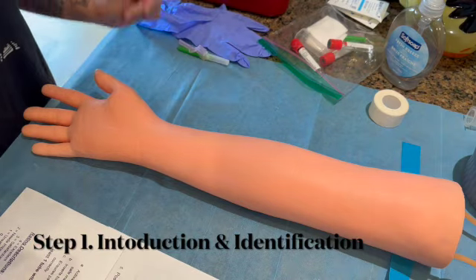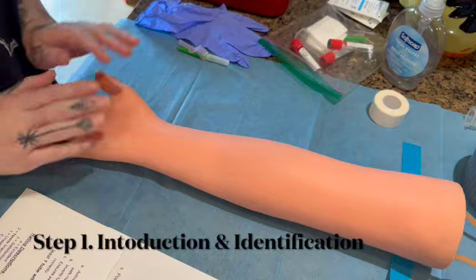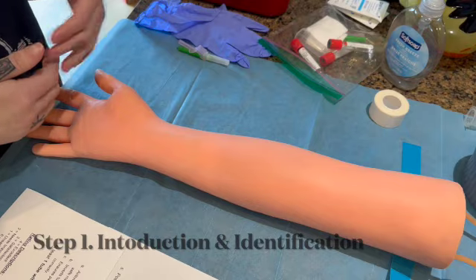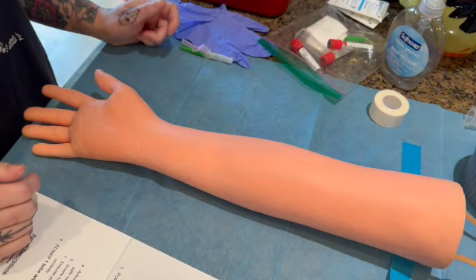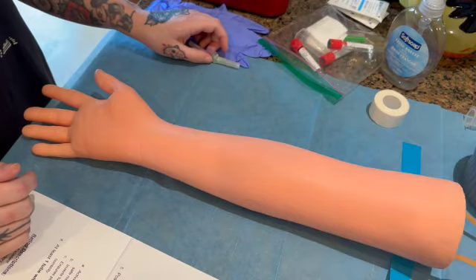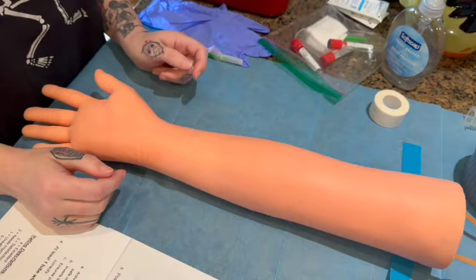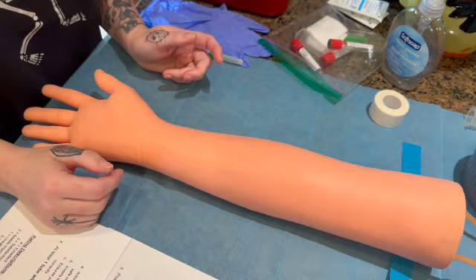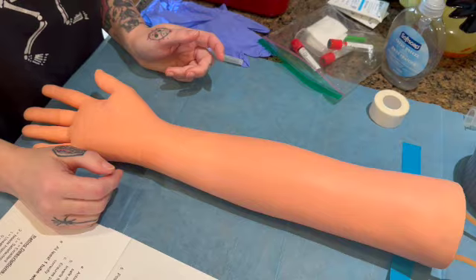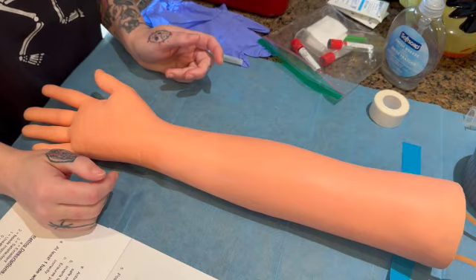So basically what that's going to look like is I'm going to walk up to my patient, right? Hi, my name is Shay. I'm going to be your phlebotomist today. We're needing to draw a couple of vials of blood. Can I please get your full name, your first and last name, as well as your date of birth? Patient's going to respond that their full name is Robert Thing Thornton. They were just born about 5 days ago, and so that would be whatever today's date is minus 5, and you guys can do that.